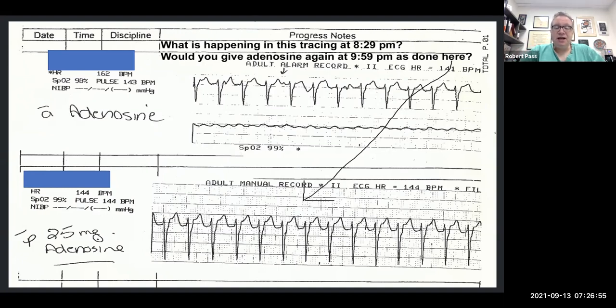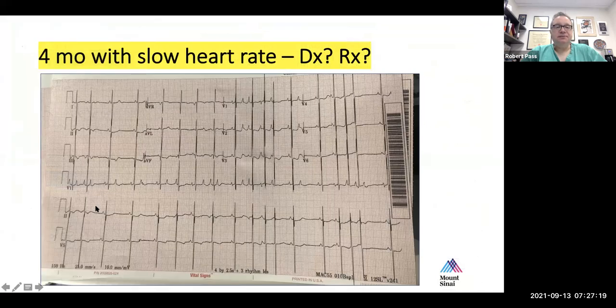And if you leave somebody like this long enough, another 24 hours or so, they will become very unstable. Also, if someone already has not such great hemodynamics and you leave them in this rhythm, they may not even tolerate it for a short period of time. So you generally don't want to leave somebody like this for a very long period of time. So very good. Okay, let's move on to the next unknown today.